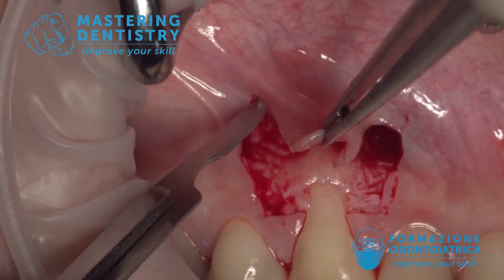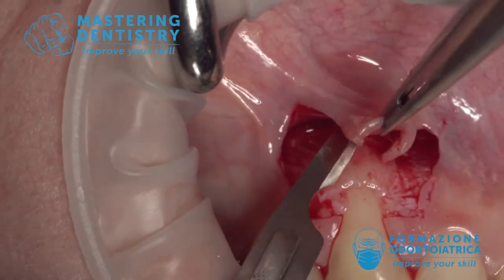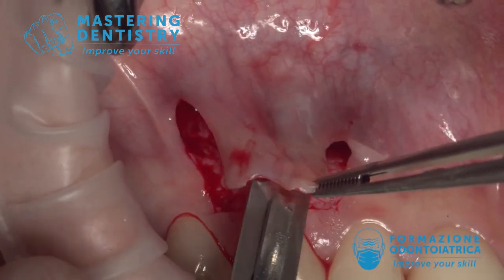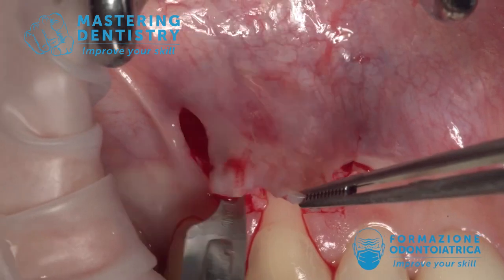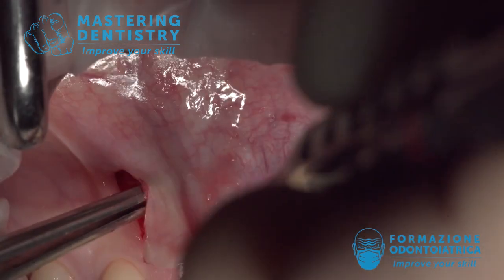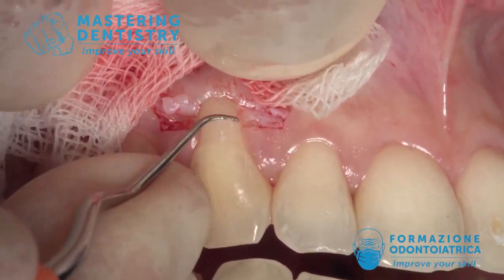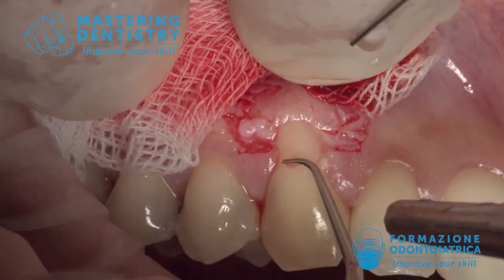The mucosa and submucosa. So now I must detach the muscles from the inner surface of the flap, sliding and surfing with the blade parallel to the superficial tissue, checking the blade this time from transparency. You see, I'm not looking underneath the flap but looking from outside. I'm keeping the muscles with the tweezers — they are independent and go into the depth — so the flap can move coronally with only the mucosa and submucosa tissue beneath.